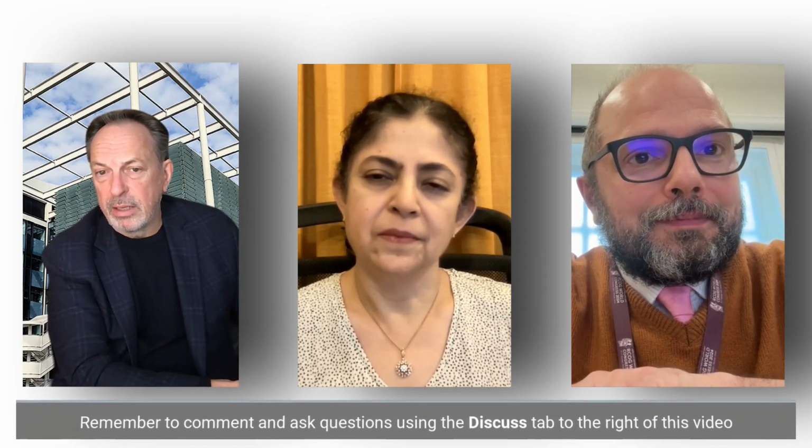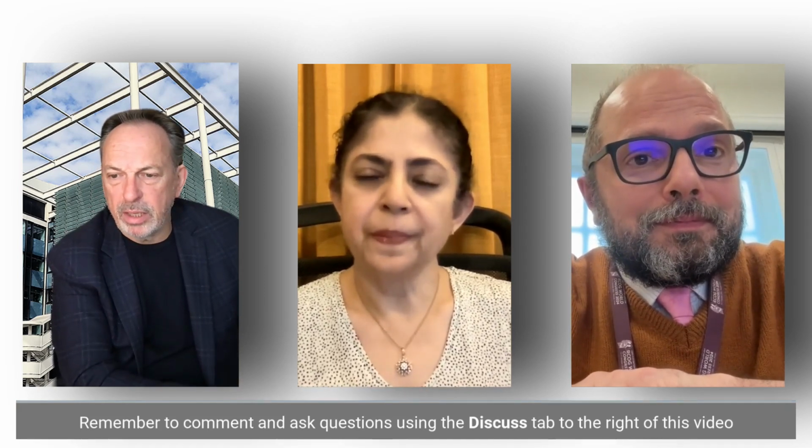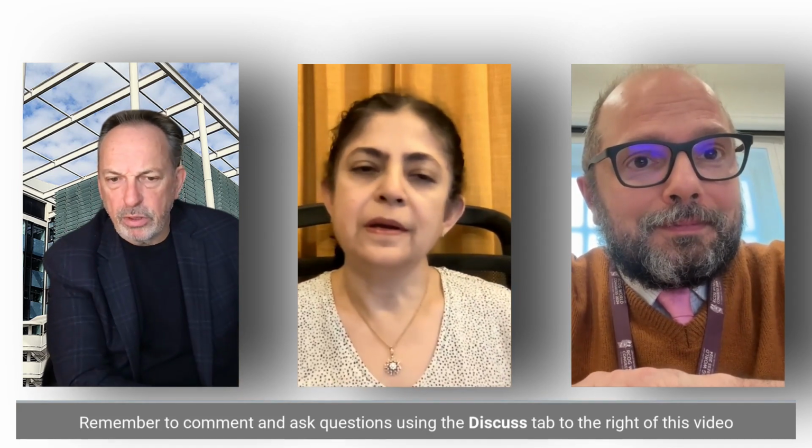It's not easy. Absolutely. I mean, the other big question, I guess, Ahmed, and also Marla, is tamoxifen is obviously a problem. Sorry to butt in here, but Marla, do you have any views on how you handle your patients who are taking tamoxifen? Yes.